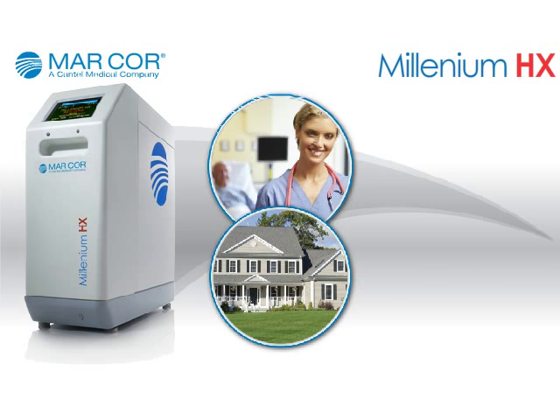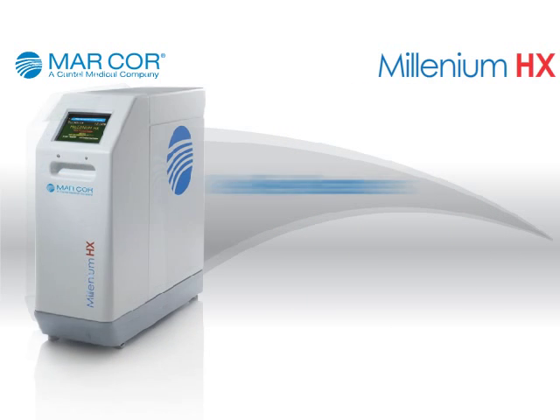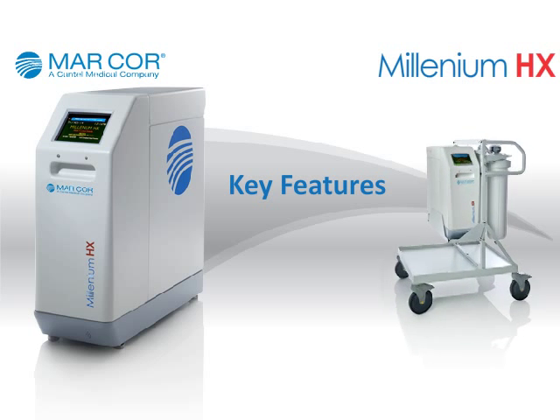The system was specifically designed with both the operator and the patient in mind. Here are a few key features and benefits of the Millennium HX unit.